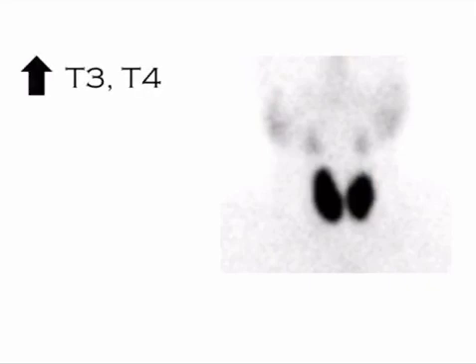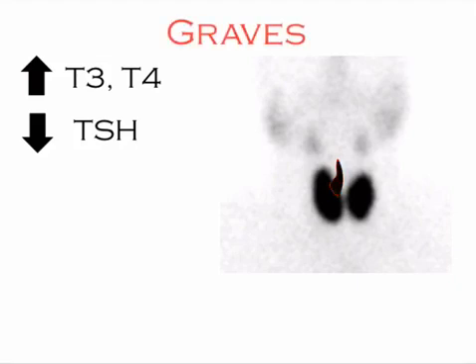So if you're given labs and you've got high T3 and T4 and a low TSH, and they show you that, the pyramidal gland, this is Graves. This is a classic look for Graves.